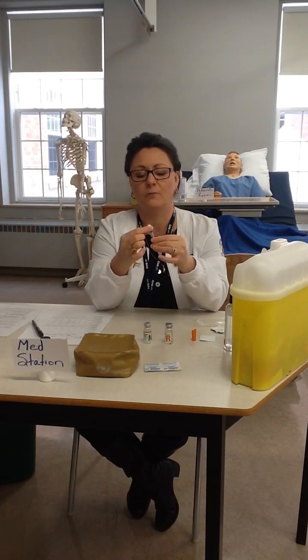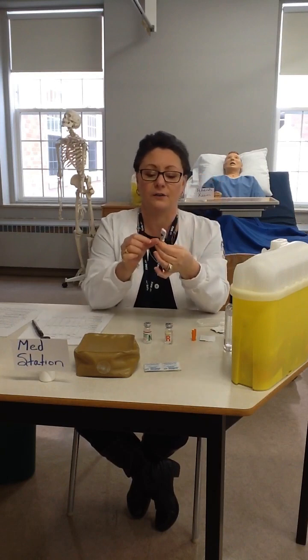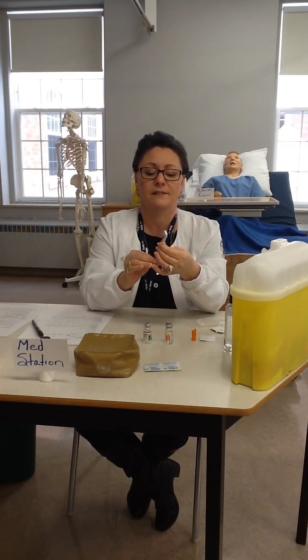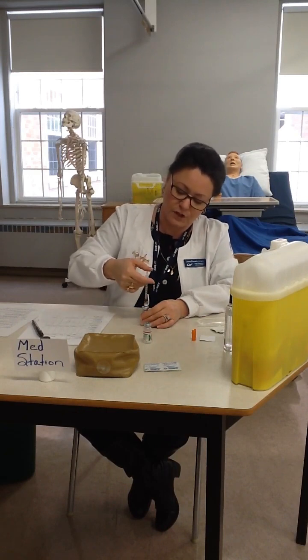And that little white arm will move all around so that you can look at whatever increments you want, whether they're odd or even. I'm going to draw up 6 units of air. So now I'm getting ready to draw up my medication. I have 2 checks done. So I'm going to pierce the top. I'm going to inject my air.